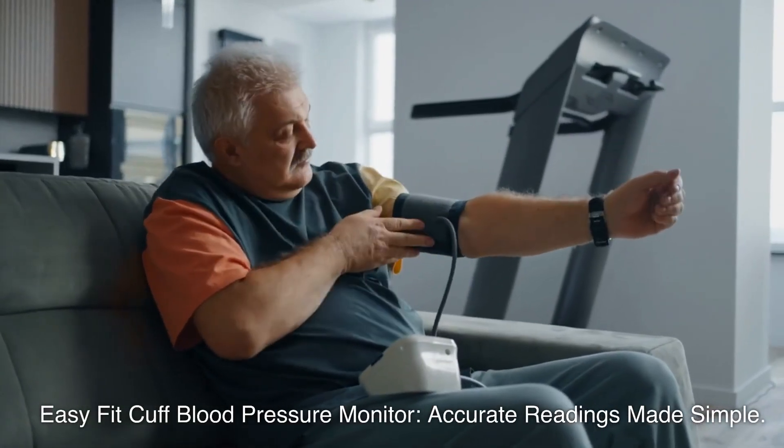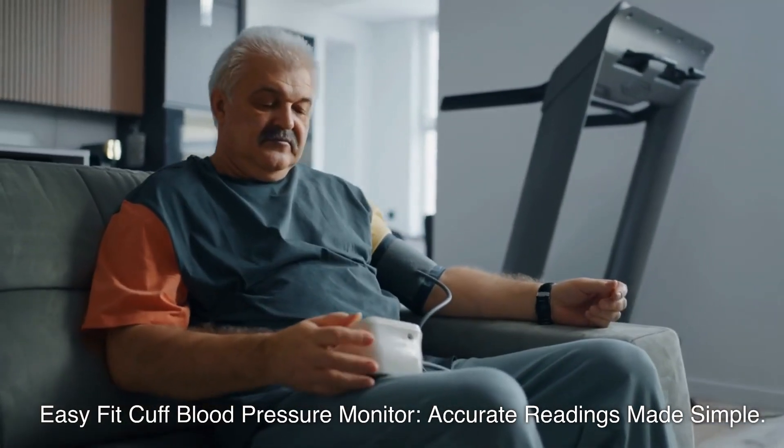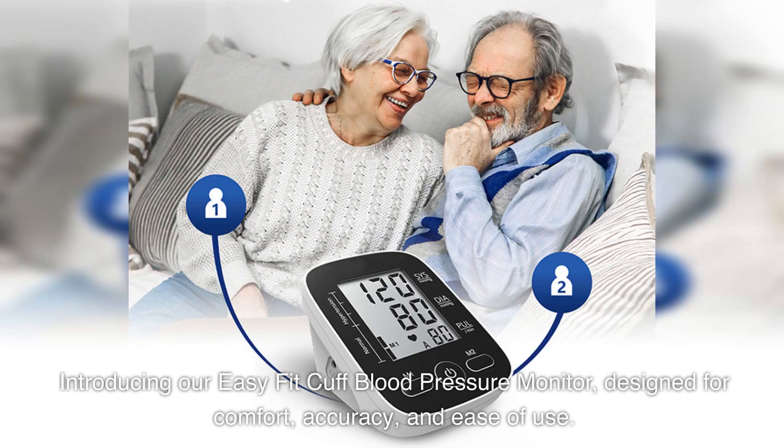EasyFit Cuff Blood Pressure Monitor — accurate readings made simple. Introducing our EasyFit Cuff Blood Pressure Monitor, designed for comfort, accuracy, and ease of use.